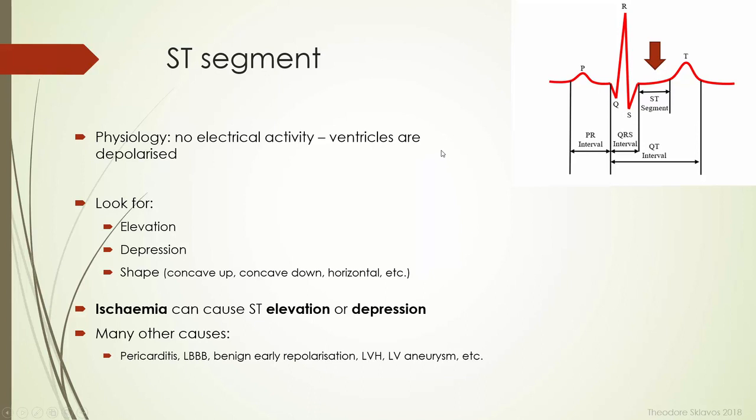Now, that's important to understand if, and I encourage you to do this, if you can be bothered reading the mechanism of ST segment elevation. The first thing you have to understand is nothing is going on electrically in the ST segment in the normal heart, okay? And when you have ischemia, it sets up things called a current of injury, and that causes your ST segments to change, but we won't go into the mechanism today.